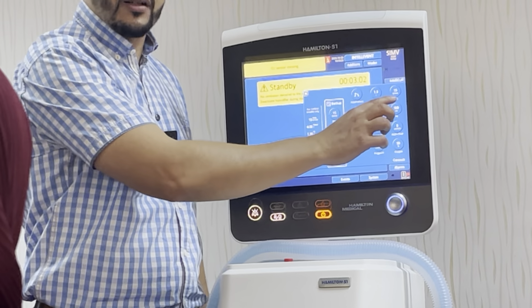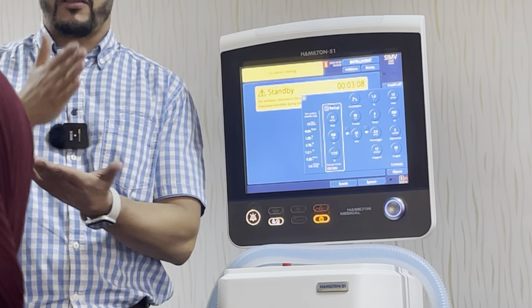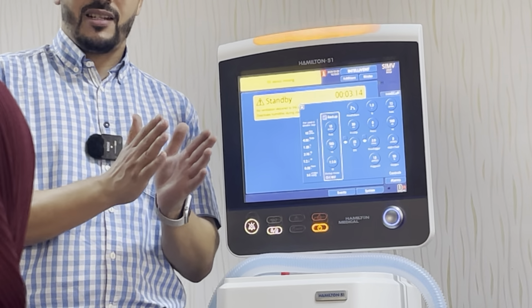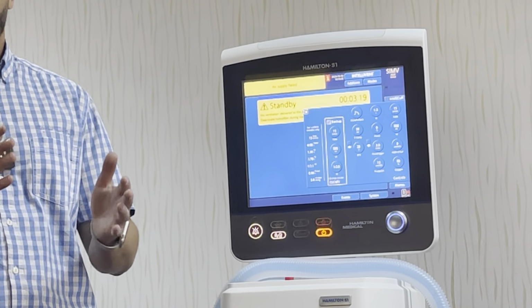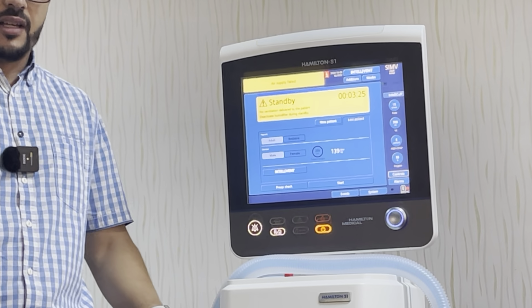فهذا هي الماشين تريجر. الماشين تريجر في السي ام في يبدا يشتغل من الثانيه رقم 0 طول يبدا يعطي، في الأربعة يبدا يعطي، في 8 يبدا يعطي. في الاس اي ام في ما يبداش السايكل في الصفر، يبقى يستناه حوالي 0.5 جزء من الثانيه. يعني الجزء الاول باش تبقى الماشين ويتنج، تستنى البيشنت انه هو اللي يبدا التنفس.